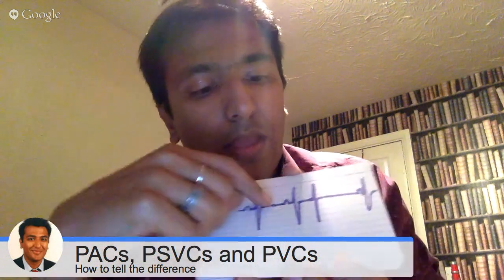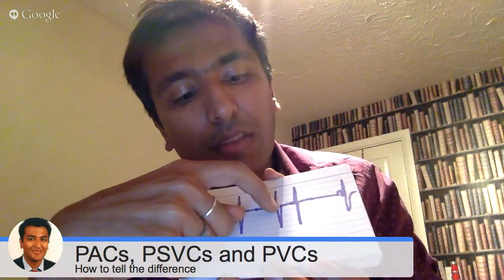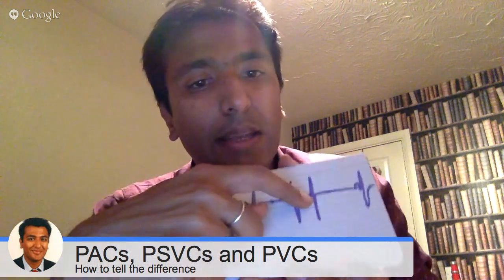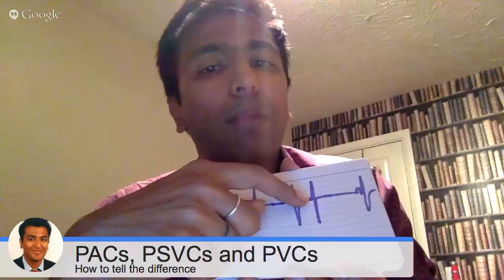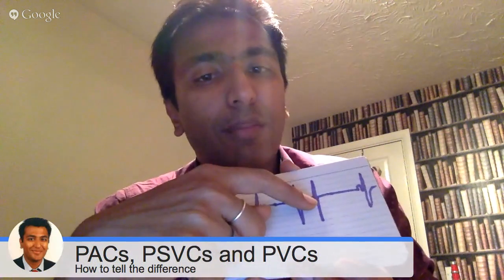So if you had the ECG paper, you would find that this should be no more than 3 small squares wide. And because this is also less than 3 small squares, I can tell you that this is a supraventricular complex. It's premature, it's come in early, it's a narrow complex, so it's supraventricular. And I can't see an abnormal P wave, so I can't call it a premature atrial complex. I can only call it a premature supraventricular complex.